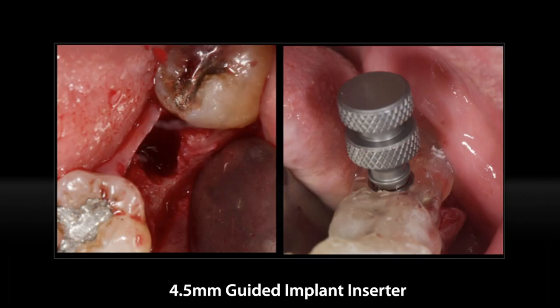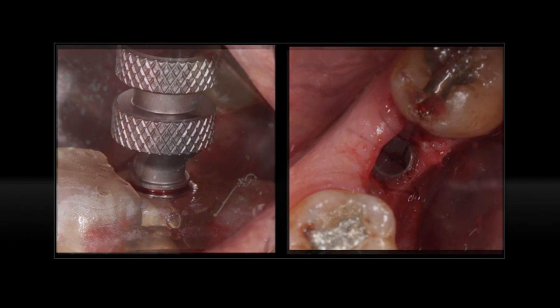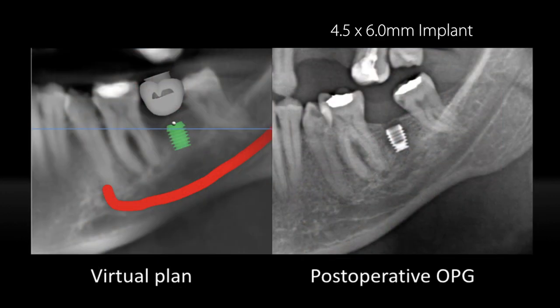Final osteotomy with a very thin buccal wall. Guided implant placement using the implant guided inserter. Then the implant in its final seated position, and grafting the buccal wall using the harvested bone and attaining a primary closure with 4-0 Vicryl suture. This is the pre-operative virtual plan and the post-operative OPG.